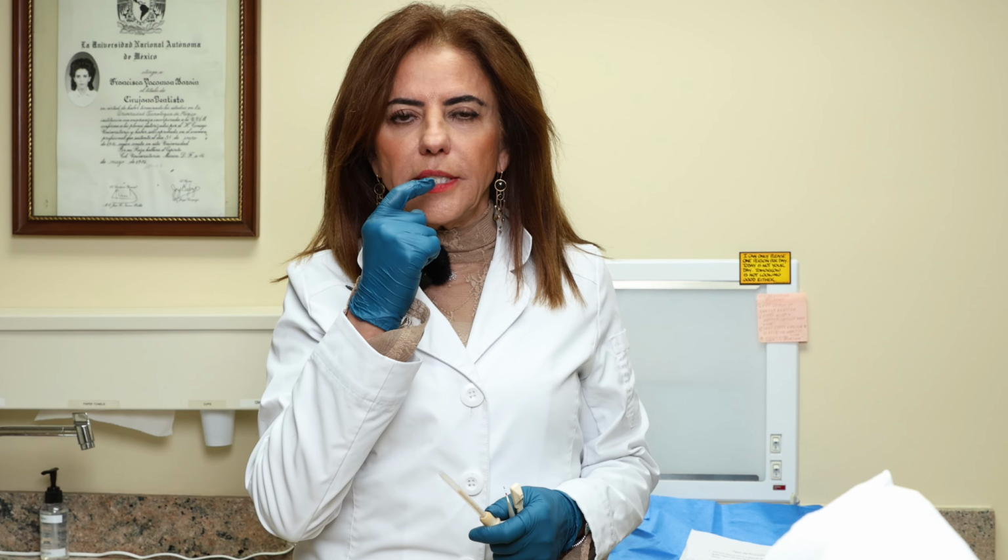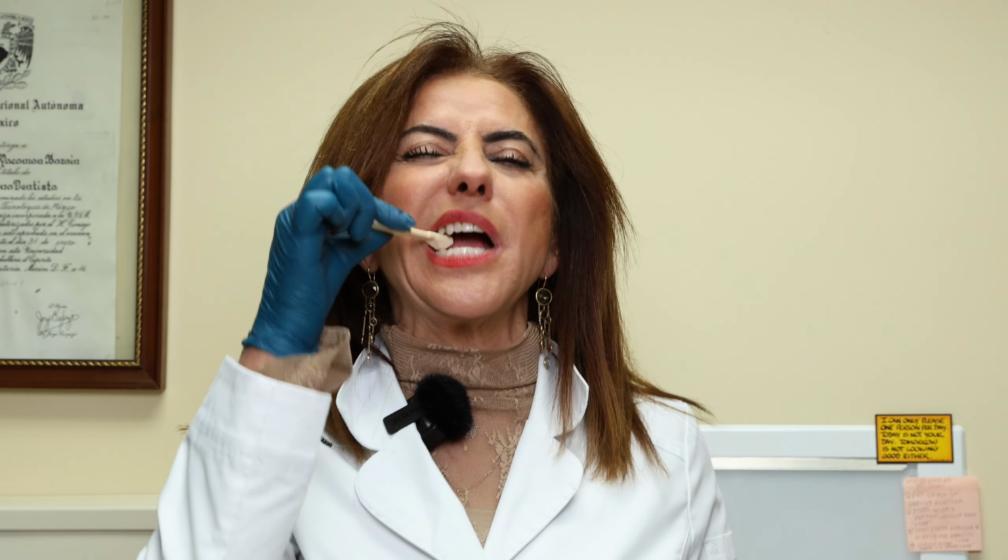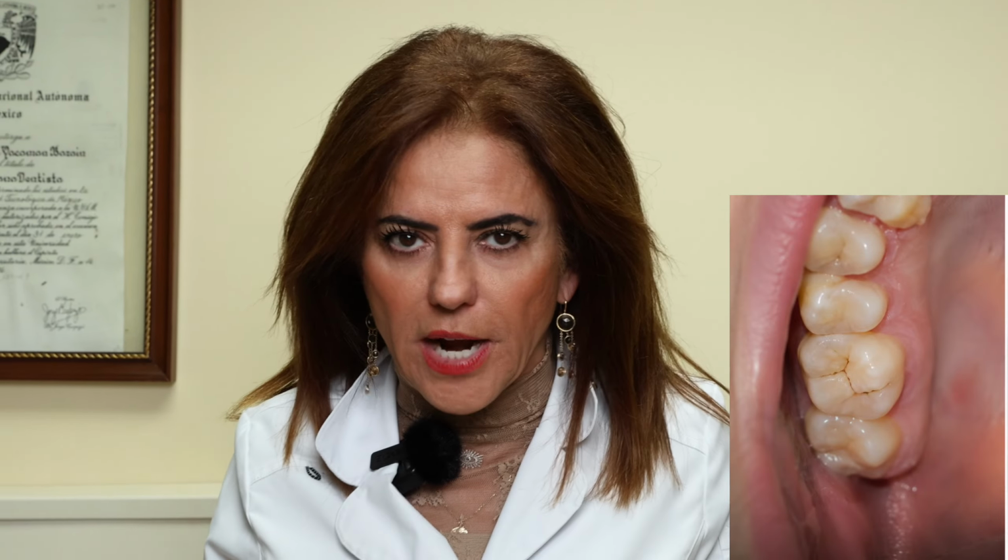They have to do the biting test, which is with this. I have short episodes on YouTube where you see the biting test and you go tooth by tooth and ask, do you have pain? No. You have pain? Oh my God, it hurts. If the pain is so sharp when you bite, even if it doesn't linger, that means that you possibly have a crack or a fracture, which is another topic. I have another episode on cracks. It's called cracked tooth syndrome. You can look at it on the YouTube channel.